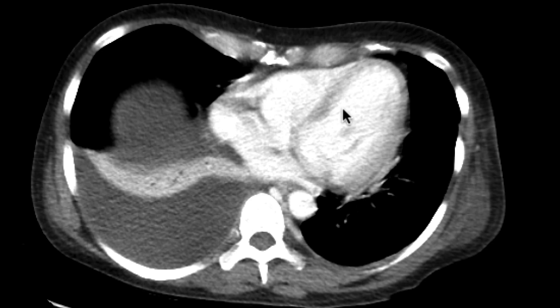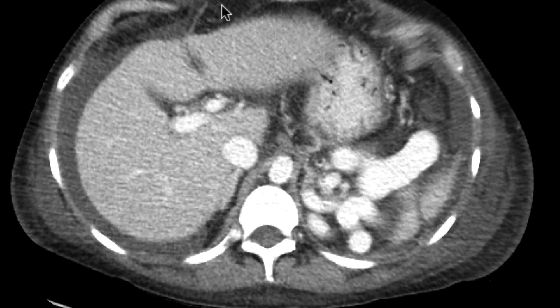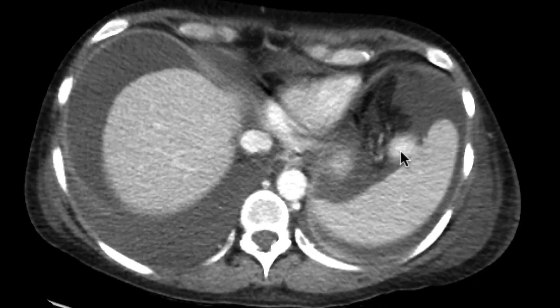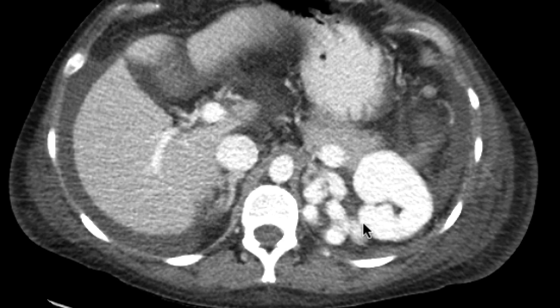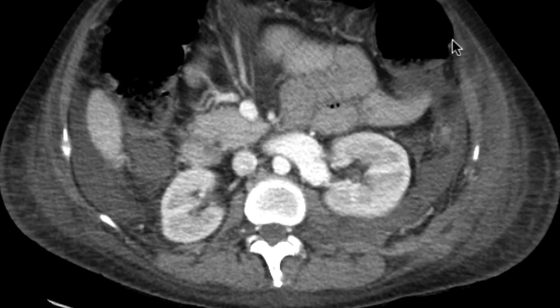We can see that there's a right pleural effusion. We'll notice that the liver is cirrhotic and there is ascites, as well as portosystemic shunts with a splenorenal shunt over here.